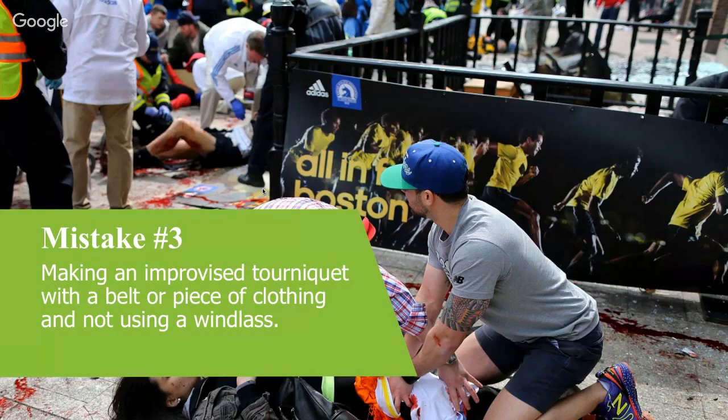But again, to make an improvised tourniquet, it needs to have a windlass of some form to get an effective compression around the limb and the tissues to occlude that artery. The studies have shown that non-windlass improvised tourniquets failed to stop bleeding in up to 99% of their applications, versus improvised tourniquets with a windlass of some form, which only failed to stop bleeding 31% of the time.